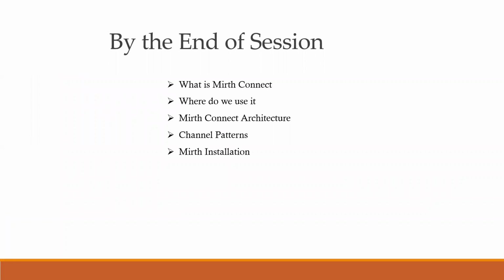Okay, so let us go ahead and begin with Mirth Connect. Yesterday we looked at the networking aspects of any integration project, and the various connectivity models we can use to implement interfaces.